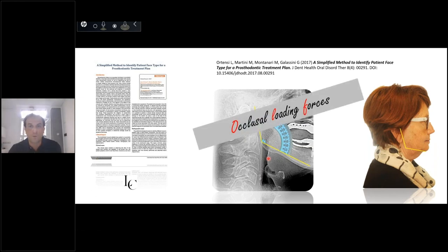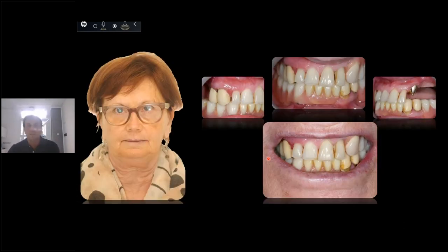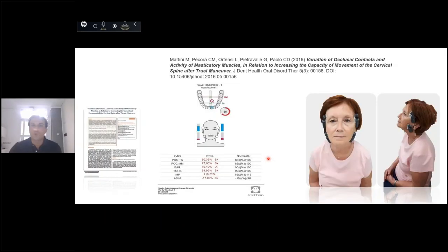And I want to know the occlusal force of this patient. It's very important. If I don't know it, I can't understand very well what the real force of the patient is, so I can use Teethan. This is the patient, and she has an old prosthesis in the lower jaw, and a whole prosthesis with hopeless teeth in the upper jaw. And now I want to change the situation of this patient.